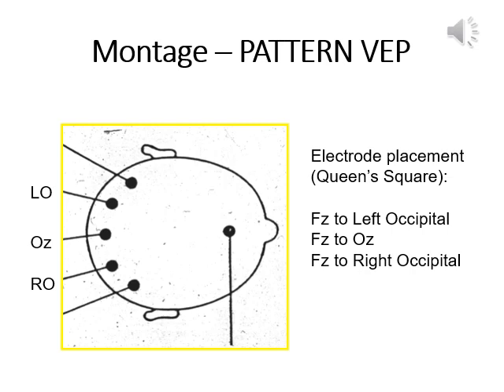When doing a hemi-field recording, 2 additional electrodes are added at the back, and these are the left and right temporal electrodes, and they are located 5 centimeters to the left and right of the left and right occipital electrodes. And so along the back, one would have the left temporal, and then 5 centimeters over the left occipital, 5 centimeters over the midline occipital, 5 centimeters over the right occipital, and then 5 centimeters over from that would be the right temporal electrode. And this is for hemi-field recordings.